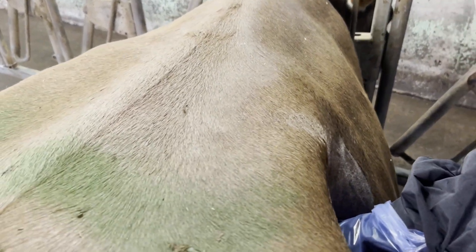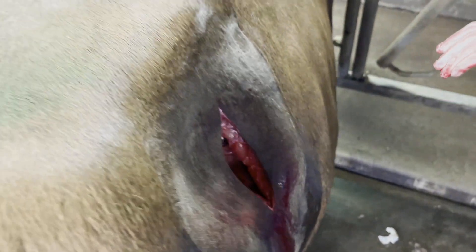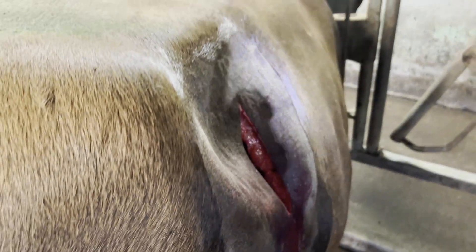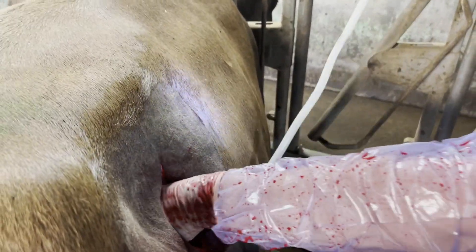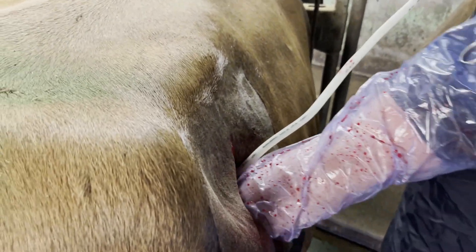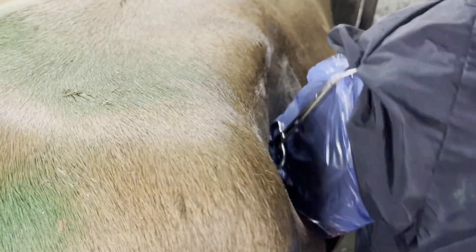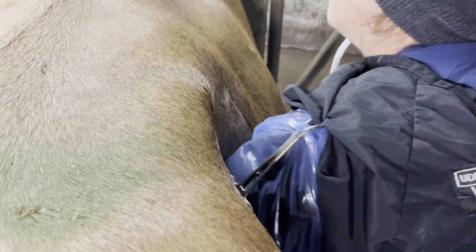The way I can differentiate the abomasum from the rumen is it doesn't have a dorsal attachment. When I go over to this side, the rumen is going to be attached to the spine, and then there's a large bubble of an organ on the other side of it that's not attached dorsally — so that's where I know where I'm going. I'm going to take my needle and tubing and deflate the displaced abomasum on this side.